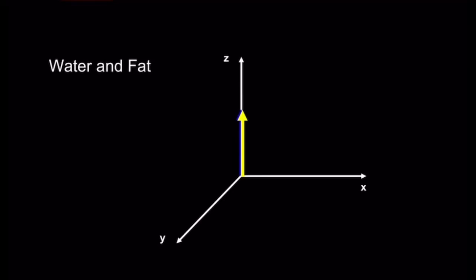If you take one thing away from the last few slides, it should be this. Any given tissue has a particular T1 relaxation time, namely how fast it recovers magnetization on the z-axis, and a T2 relaxation time, how long it takes for transverse signal to decay. And we can differentiate tissues based on this, which is the whole point of imaging.